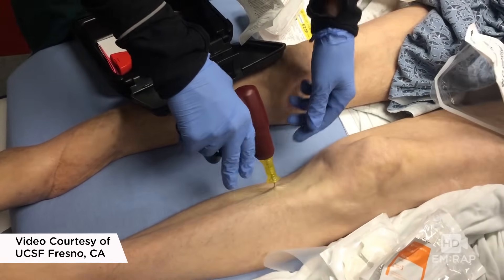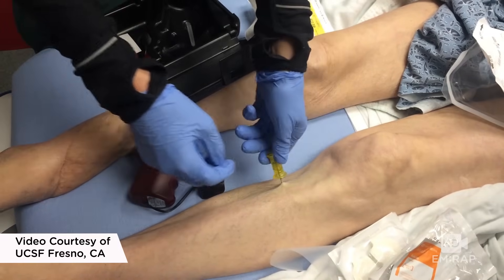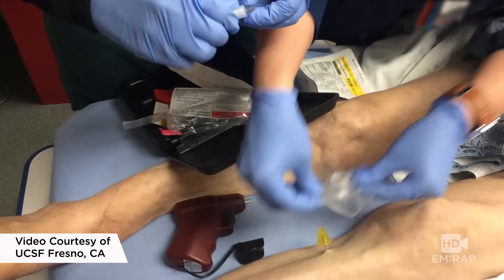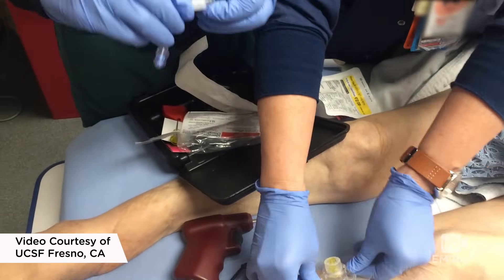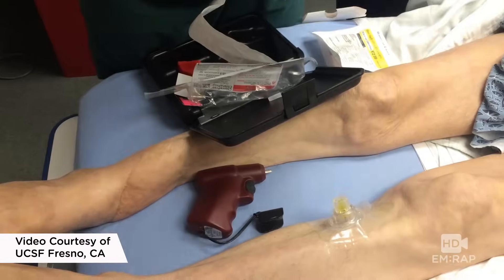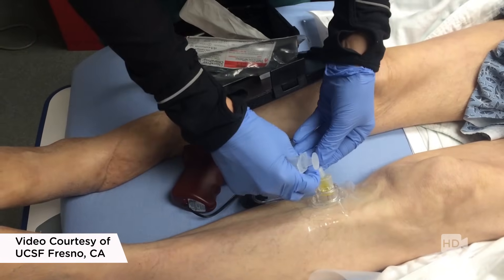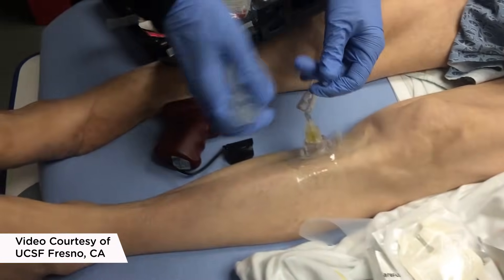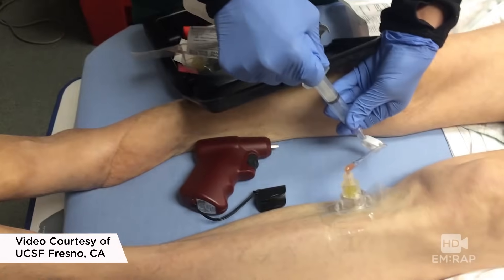Don't push it beyond that because you don't want to go through the medullary cavity. Now you remove the stylet and you can place that fancy, beautiful dressing. And now you can hook up your tubing. They're going to draw off some labs here, which is great for things like H&H and type and screen, but some elements of your chemistry panel are going to be very different from your serum levels, so you want to be careful.